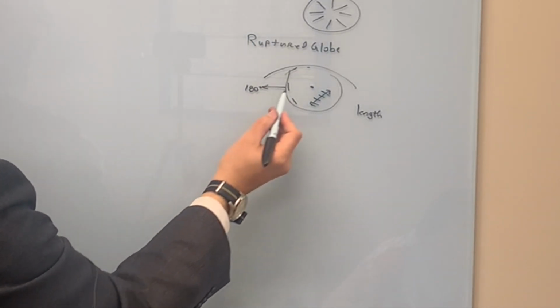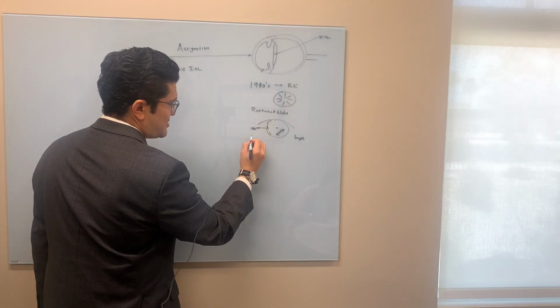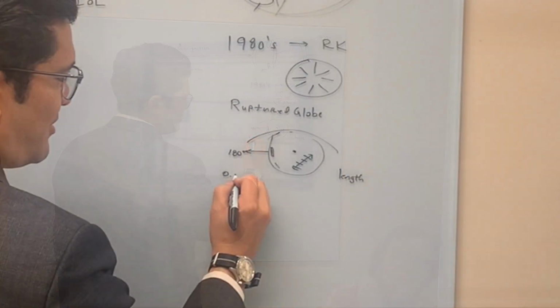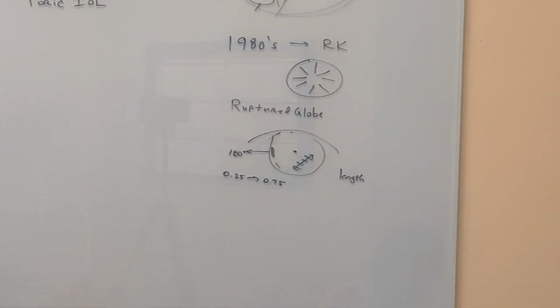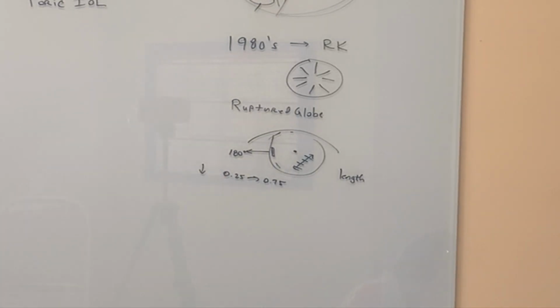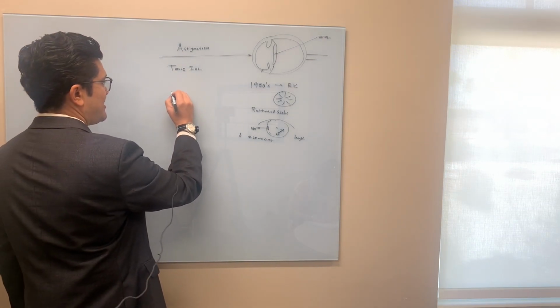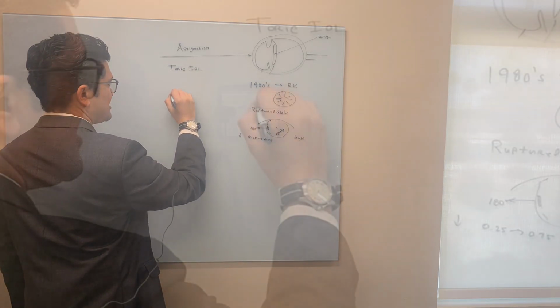because a lot of cataract surgeons notice that when you do your incision here, it's going to reduce or change the corneal curvature in that axis where you did your incision by anywhere from 0.25 maybe to 0.75, depending on what type of incision you make. It can change or reduce the astigmatism by that much. That's just by incision management. So anything on the cornea, we're going to call corneal cuts or corneal incisions.